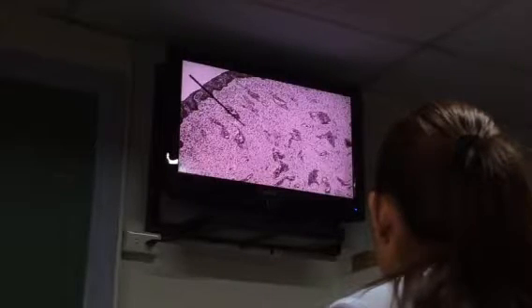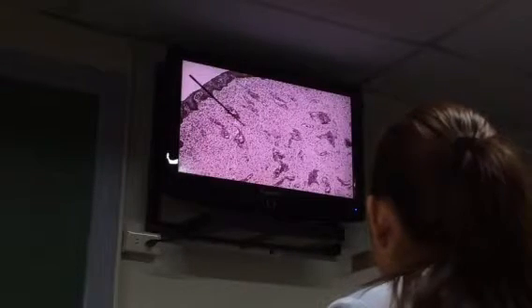reproductive system that you're supposed to take up last week. So today's topic is male reproductive. So the first slide we're going to take up, again, is your testis, slide number 66.